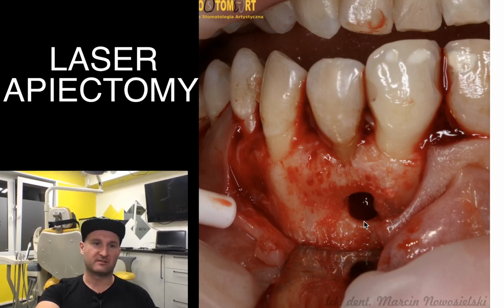And absorbing this light in the cells of bacteria causes apoptosis of their cells.